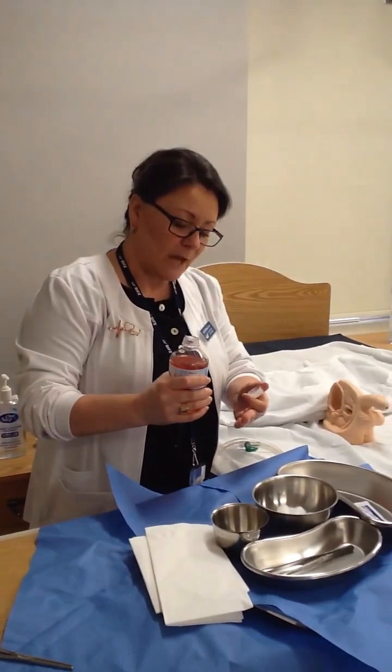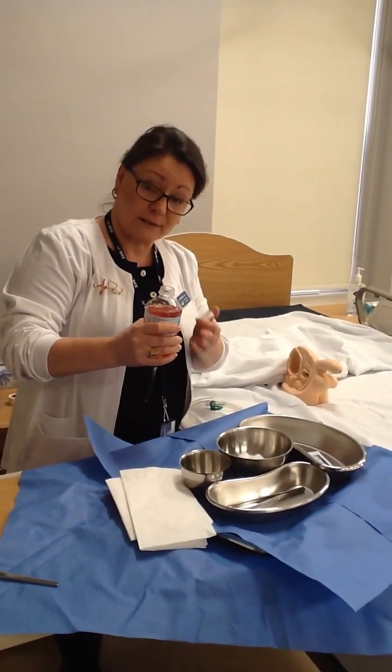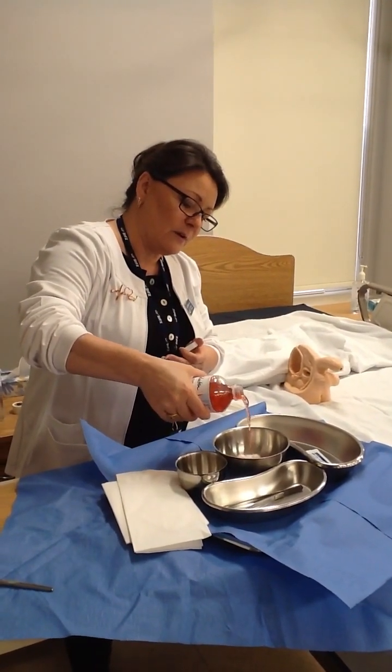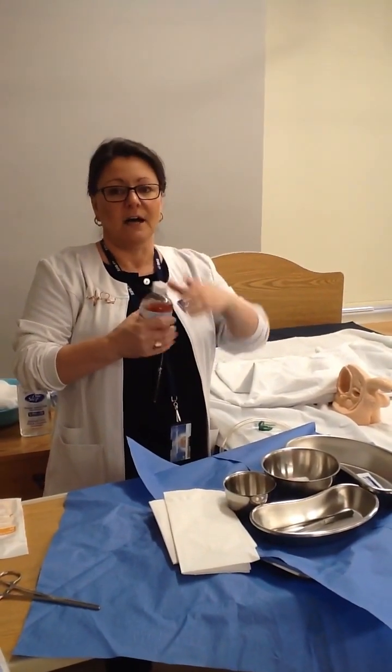I'm going to advance towards my bowl. I'm holding it up high enough that nothing touches the blue drapes, but I also don't want to splash. And I'm just going to cover the cotton balls, just enough to saturate them. You don't have to go crazy. And in our disposable catheter insertion sets, often the cleansing solution's already in the kit.